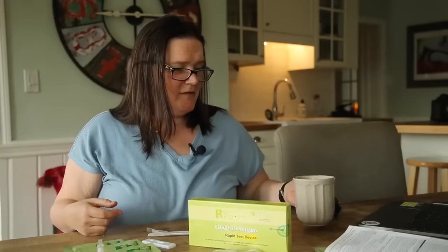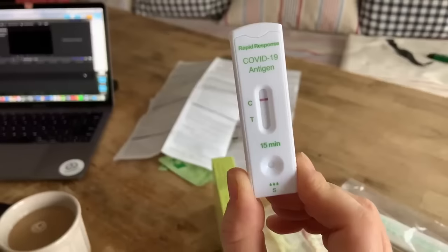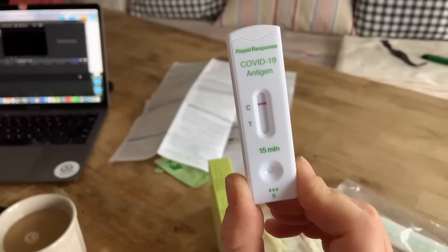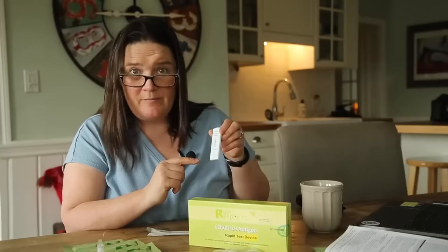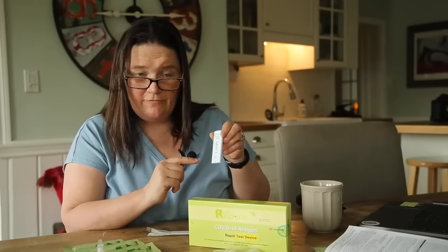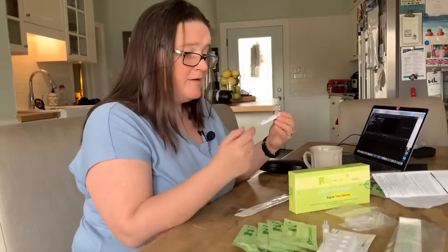In the time it took to make a nice cup of coffee, we have our results — yay, I don't have COVID! We have one line on the C. If there was another line on the T, we'd have to go get a PCR test to confirm and isolate while waiting for those results. But it's really not that hard. So use your tests for your kids over Christmas and hopefully they'll all be able to go back to school in January.